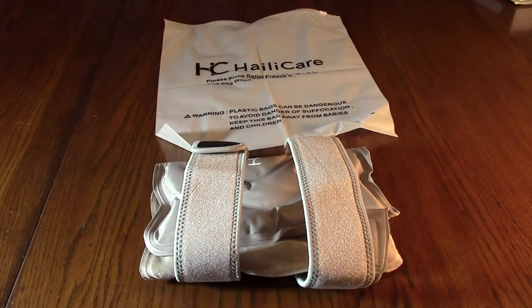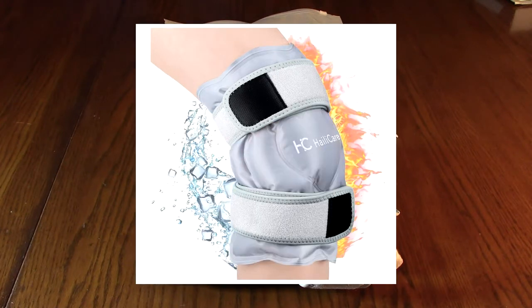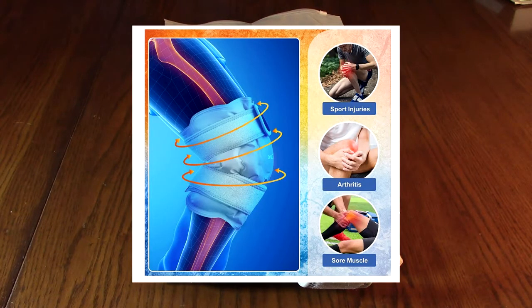Hello again, this is Robert Veach here. This is my video review of the Haley Care brand, their knee ice pack for injuries. It's a reusable gel ice wrap with cold compression and also heat compression, and has straps to hold it securely in place.